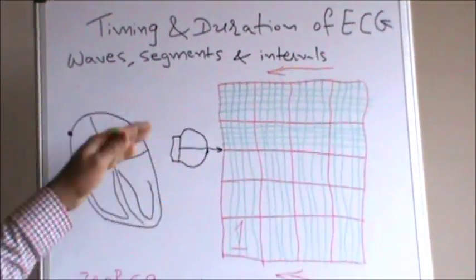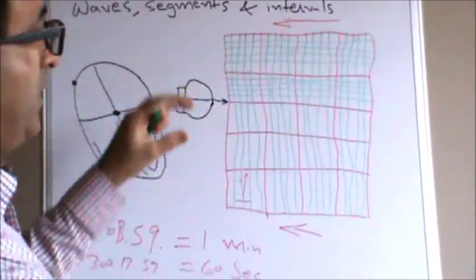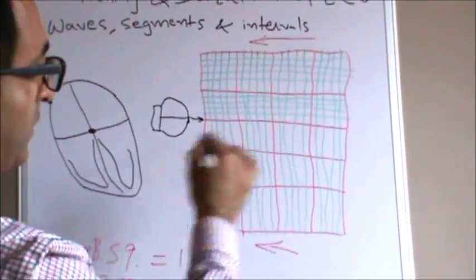And likewise, you can have it in your entire ECG tracing, but just to simplify the concept, I have just drawn it here. You could finish the remainder of the lines.